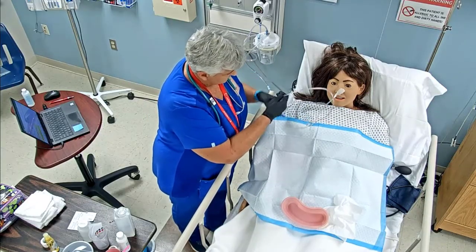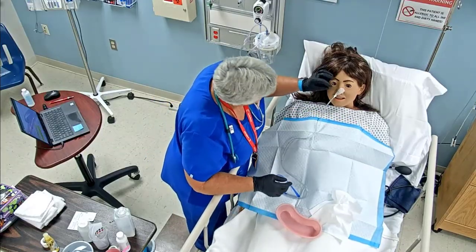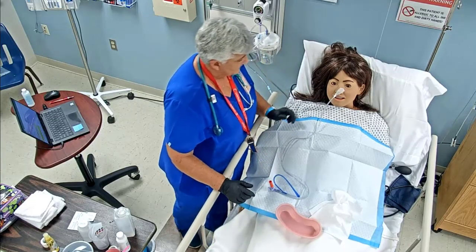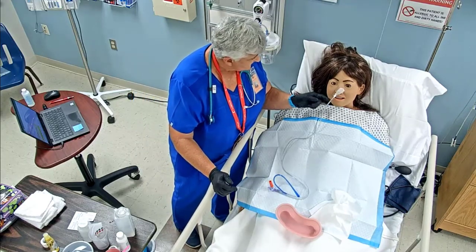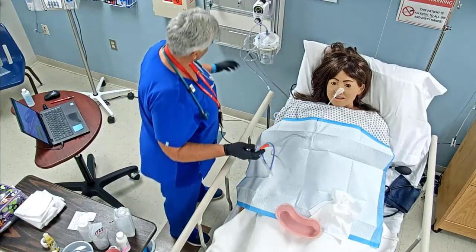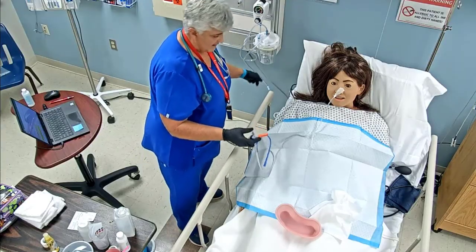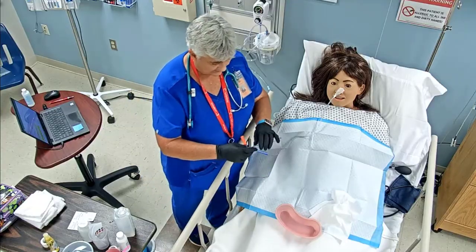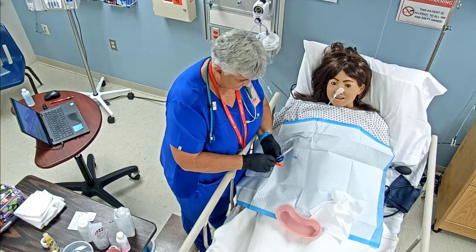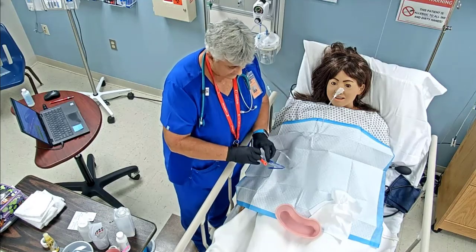Okay, so we've already checked your abdomen. I'm going to be checking your marker, to make sure you're at the right mark. And it is. Then we're going to remove. Now, if we were hooked up to suction, we would turn it off and disconnect the suction, because we'll deal with that in just a little bit. I'm going to connect this right here.